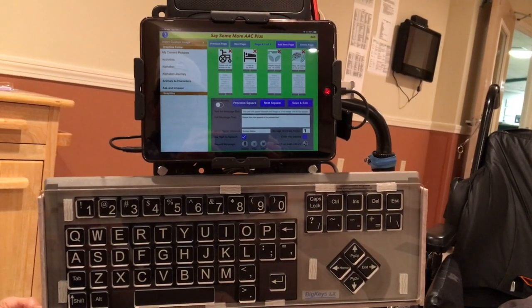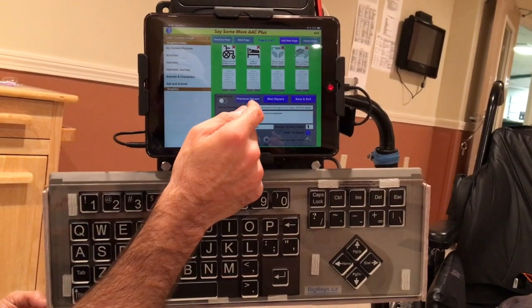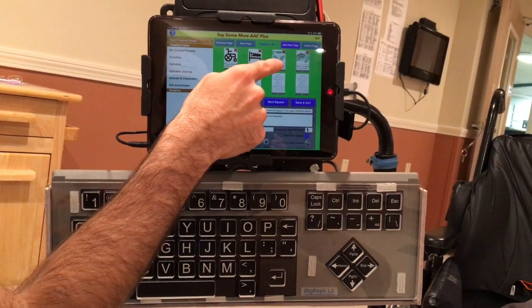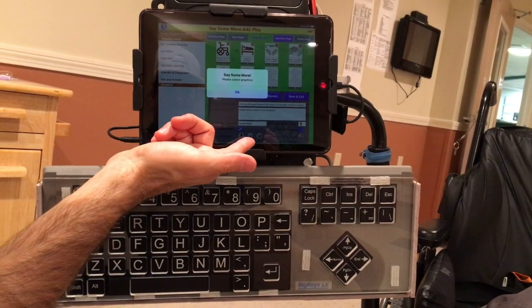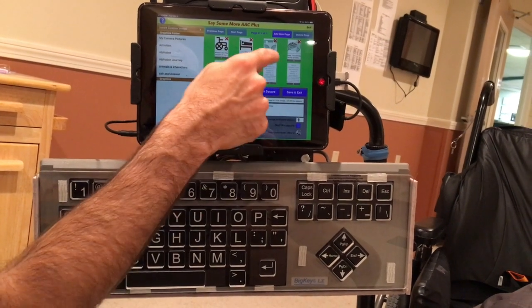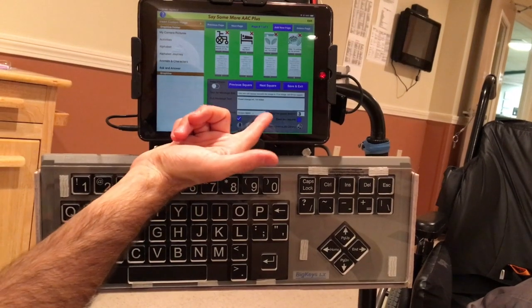So let's say we want to edit this one with the diaper. So this one is, please change me, I'm soiled. So we can't just click on it because it's going to say, put in some graphics. It's kind of confusing. What you do is you change this number to number 3 to get to this diaper here. So you go next square, next square. Now we're in the diaper.